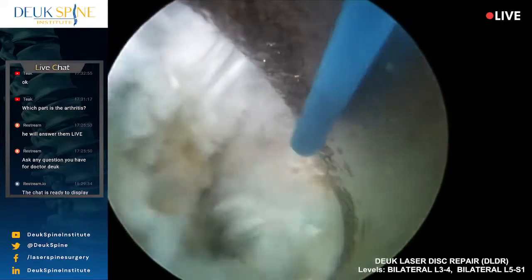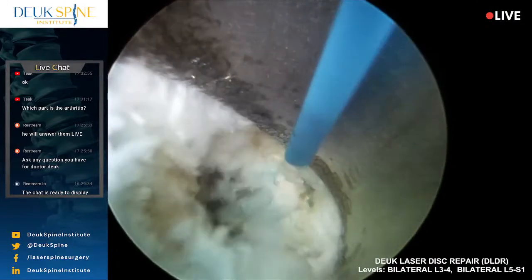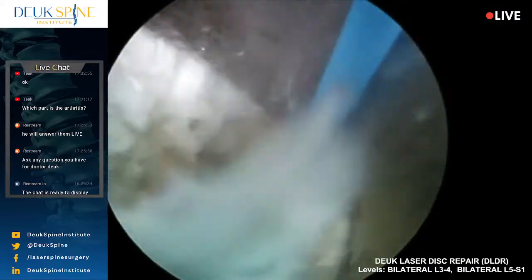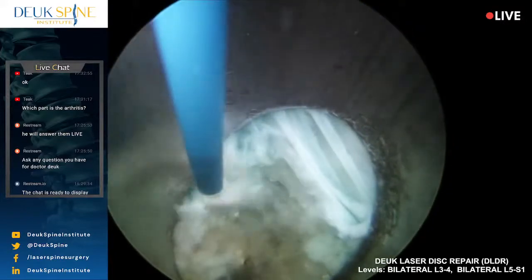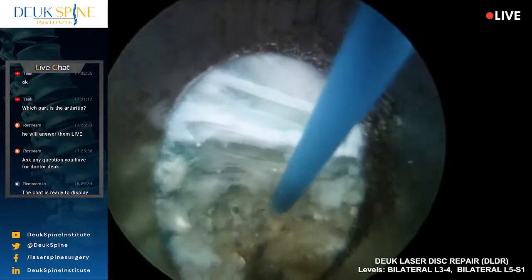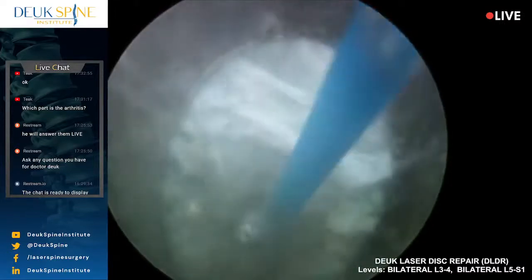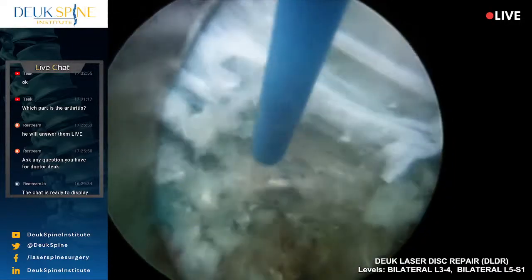This is again lateral, and you want to be careful out here because there's some stuff up. But I remember when I first started doing these, I didn't understand what this area was over here. But now I understand it. It's a lateral disc. It's in the foramen. You know, just superficial to that is out in the foramen laterally, and you don't want to go there. It's no man's land. Stay away from it. There's bad things out there. But otherwise, this looks really good.